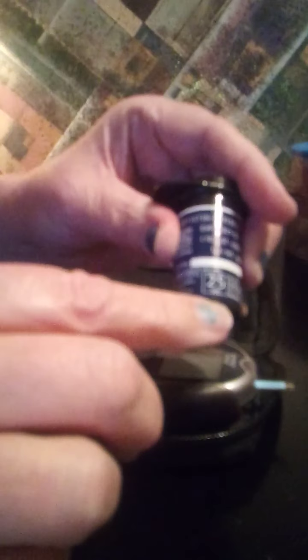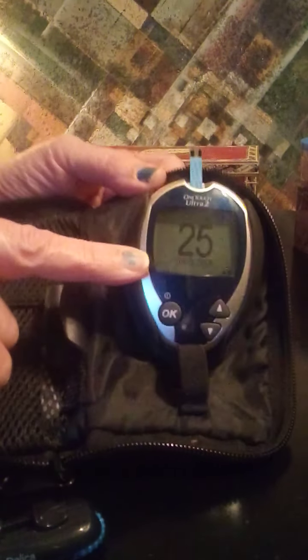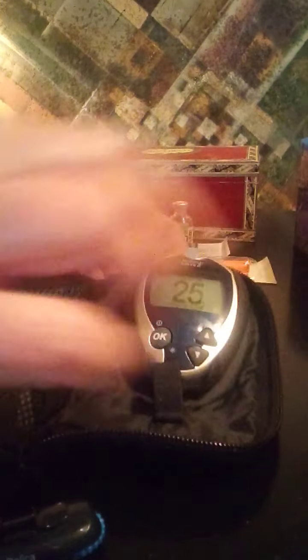The number 25 came up on the screen, and here's the matching number on the container of test strips. Let's look at that again. Put the test strip in, and the number that pops up should match the number on the bottle of test strips.